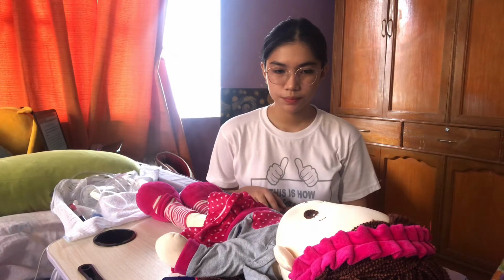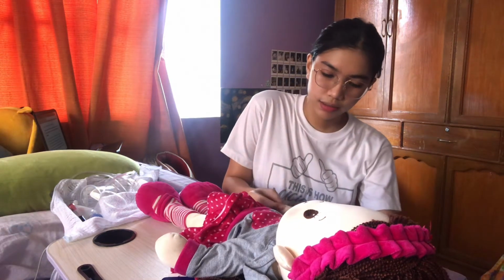Introduce yourself and verify the client's identity. Explain to the client what you are going to do, why it is necessary, and how the client can cooperate. Good morning, ma'am. I am Trisha Cuevo, your student nurse for today from College of the Immaculate Conception. May I know your name and birthday? May I check it on your wrist tag?